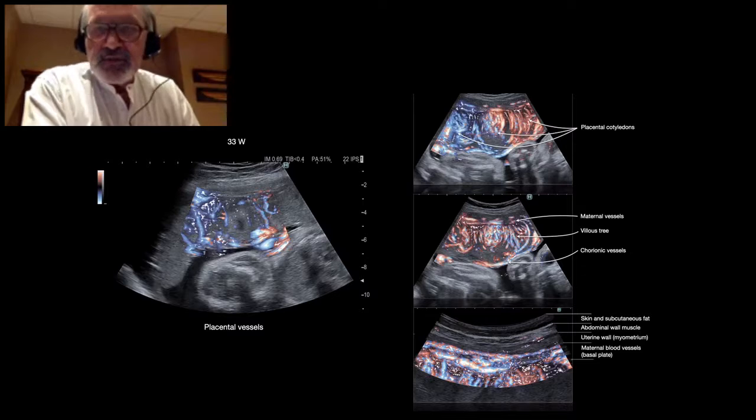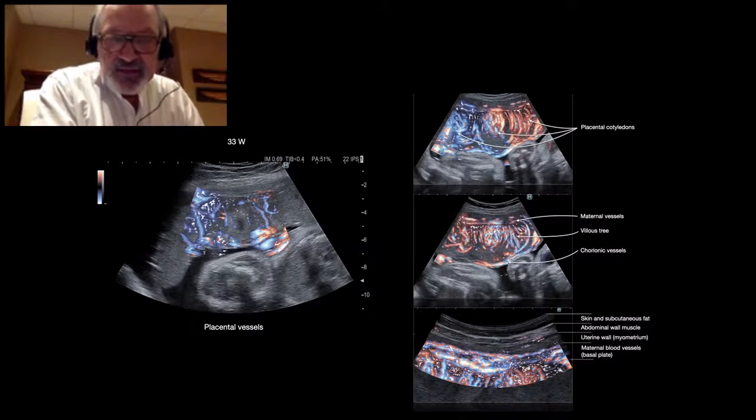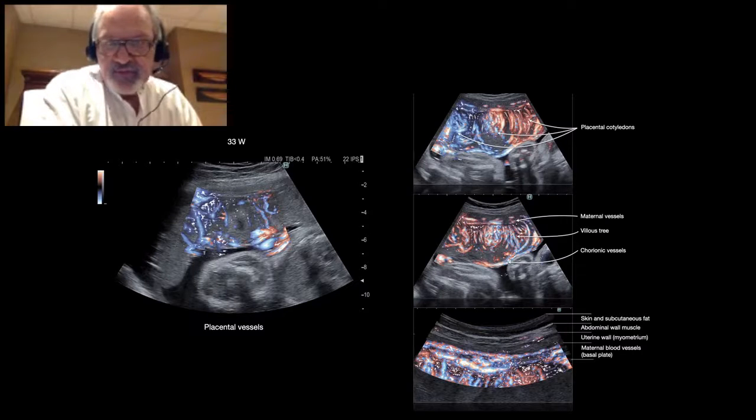So, in conclusion, I would say that the DFI method seems promising to improve the diagnostic analysis in many fields, providing a more detailed evaluation in fine vascularization due to a good resolution and a high sensitivity from this technology. I tested this solution in Aplio 855 and 755, and I was very, very satisfied. Thank you for your attention.